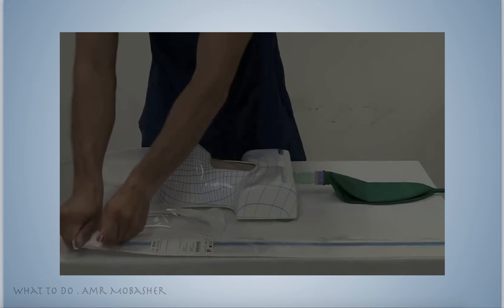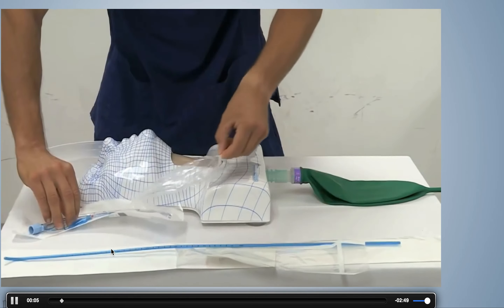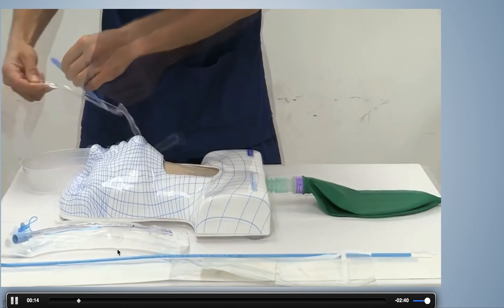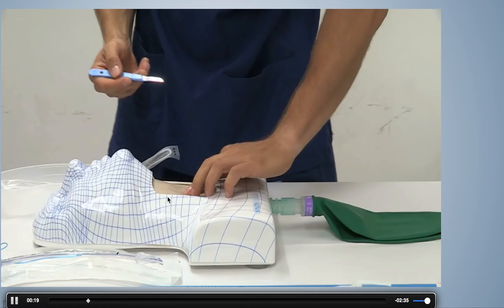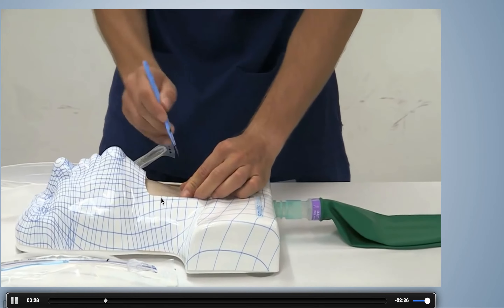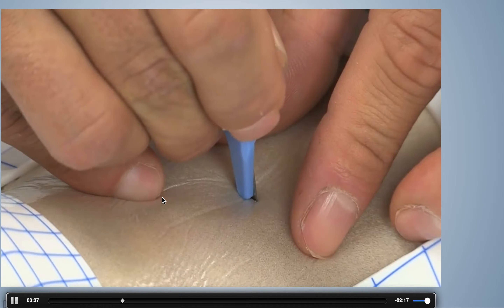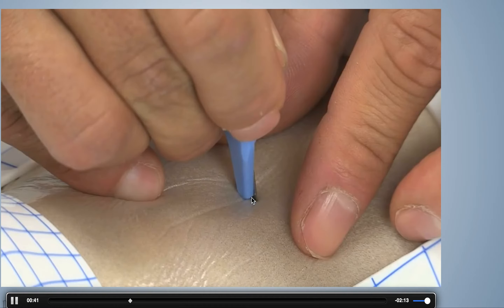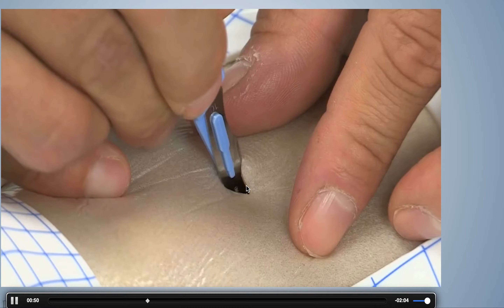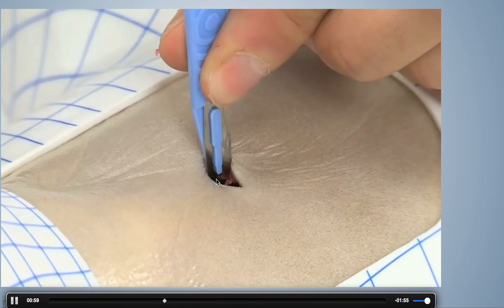A standard Frova bougie with a 15mm rapid-fit connector, a size 6 endotracheal tube, and a size 10 scalpel blade are required. The non-dominant hand identifies and stabilizes the cricothyroid membrane. If the cricothyroid membrane cannot be identified, the trachea may be used as an alternative if easily palpable. Using the dominant hand, a stab incision is made into the skin and underlying airway with a size 10 scalpel, sharp edge toward you. After feeling a pop, gentle traction is applied before rotating the scalpel 90 degrees with the sharp edge pointing caudally.